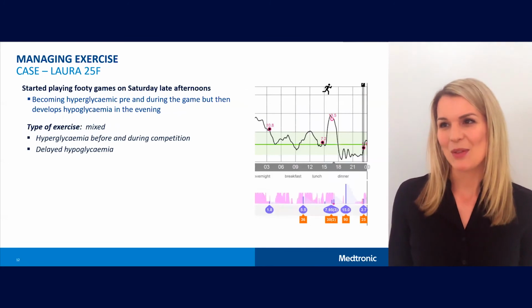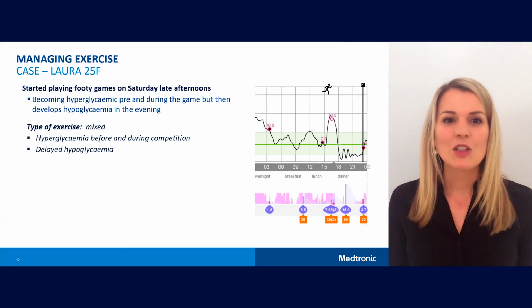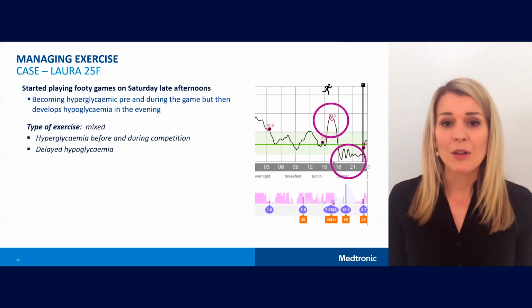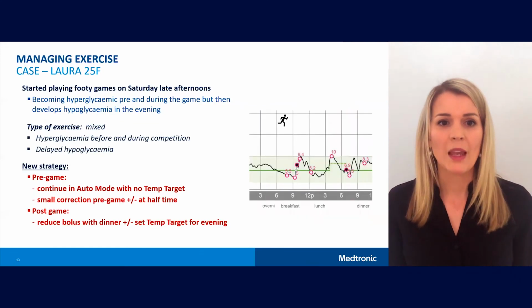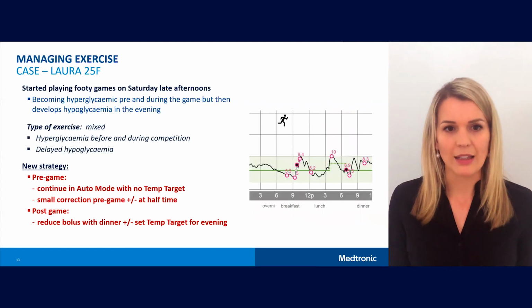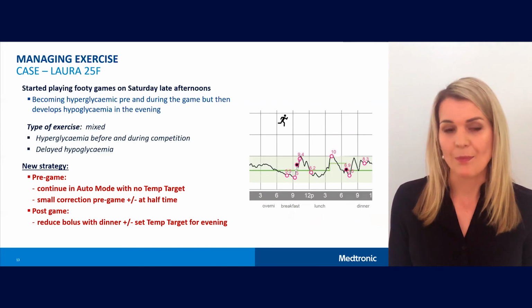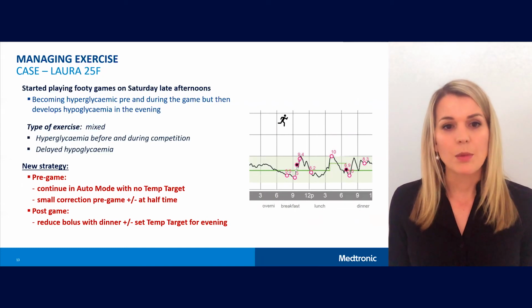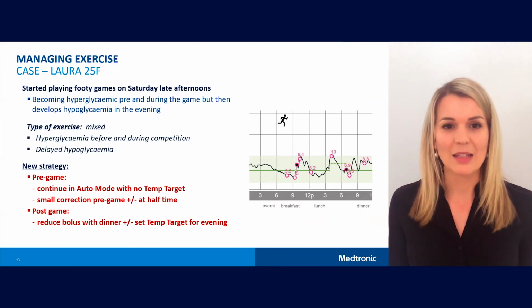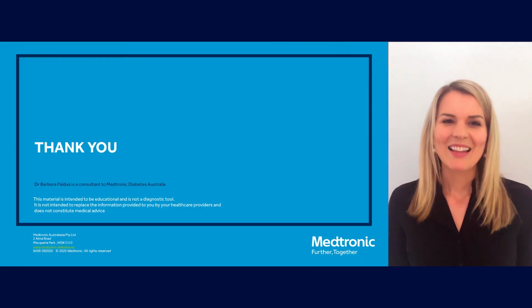Here we have Laura, a 25-year-old female who started playing footy games on Saturday late afternoons. She's becoming hyperglycemic pre and during game, and then having hypoglycemia in the evenings. We recommend that before the game she continue in auto mode with no temp target, and add a small correction before the game and at half time. For after the game, reduce the bolus with dinner and set a temp target for the evening to target the delayed hypoglycemia. And the result? More stable glucose levels.